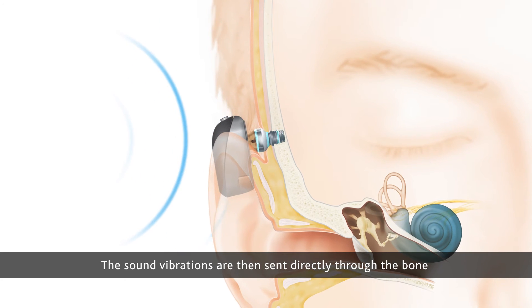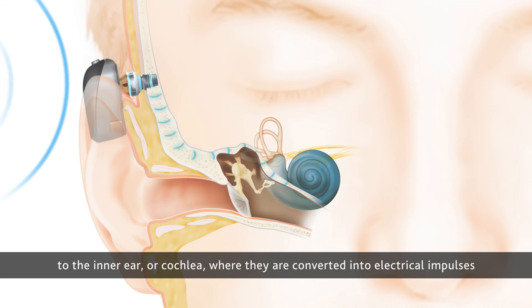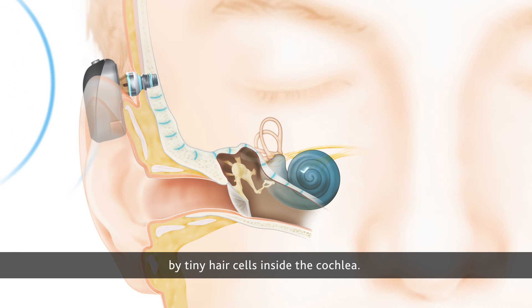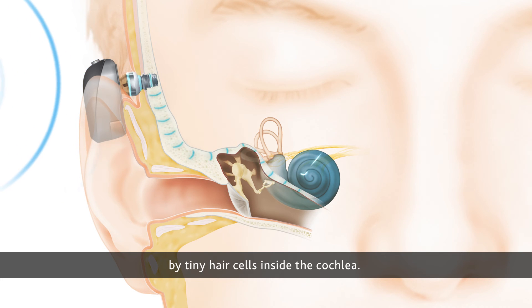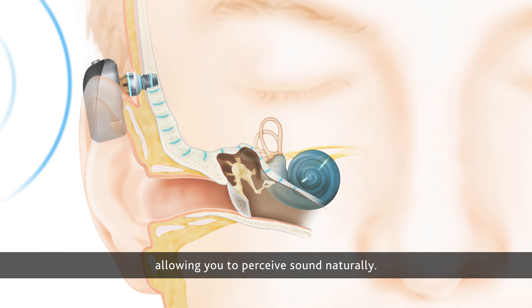The sound vibrations are then sent directly through the bone to the inner ear, or cochlea, where they are converted into electrical impulses by tiny hair cells inside the cochlea. These impulses travel to the brain, allowing you to perceive sound naturally.